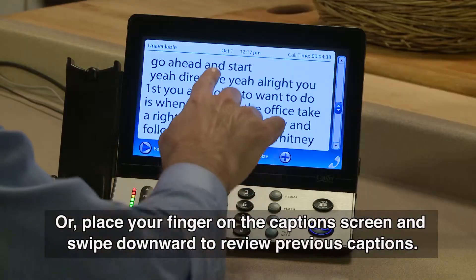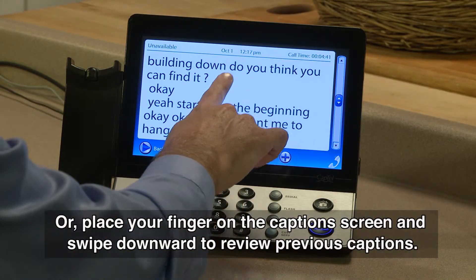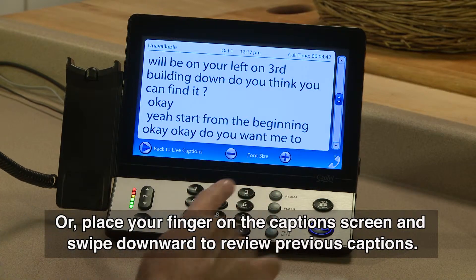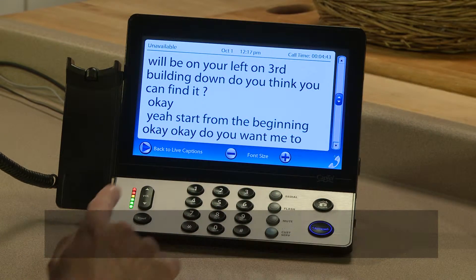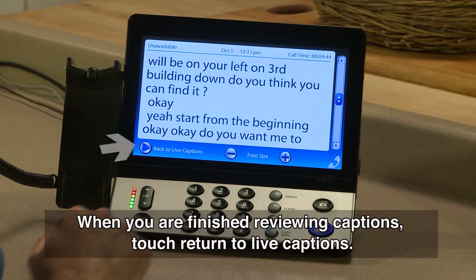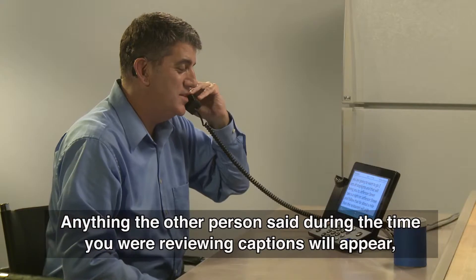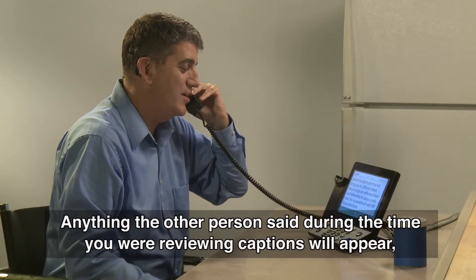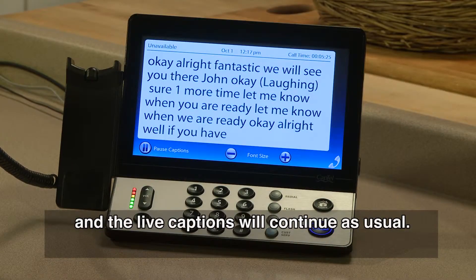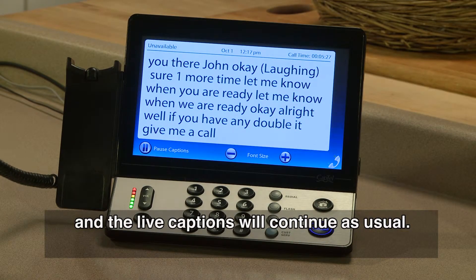Or, place your finger on the captions screen and swipe downward to review previous captions. When you are finished reviewing captions, touch Return to Live Captions. Anything the other person said during the time you were reviewing captions will appear, and the live captions will continue as usual.